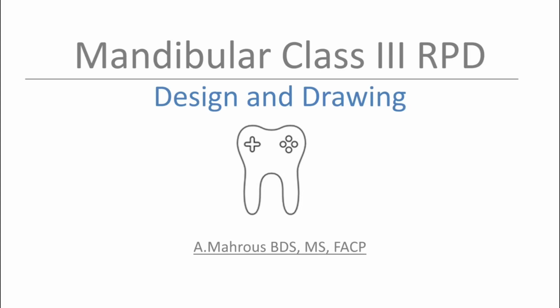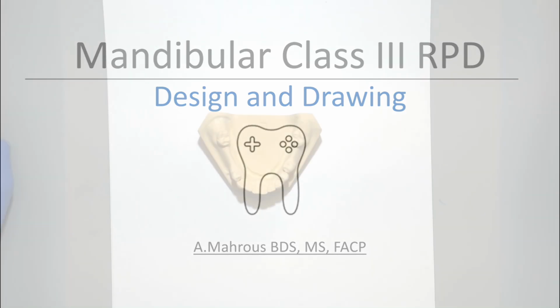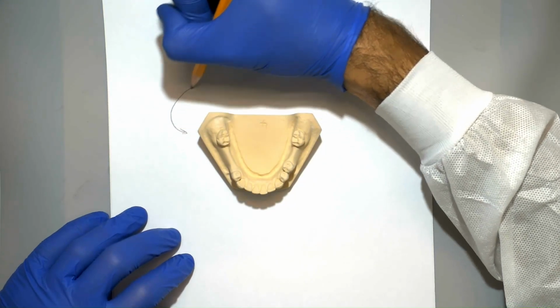Hello, in this video, we'll be going over how to design and draw a Mandibular Class III RPD. Before we start, it's important to have a plan.